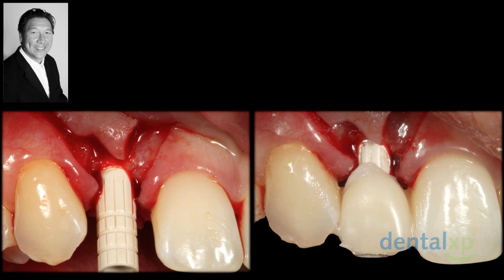The beauty behind the provisional restoration is that we like to advocate having a more palatal approach or bias to the implant to be placed, so that the access hole is coming out the cingulum and no further than the incisal edge position of the final provisional restoration. Placing it in this manner does allow me to then create a screw-retained provisional.